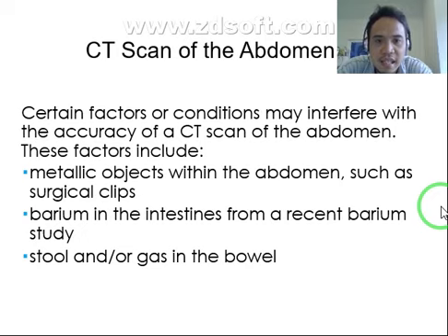Barium in the intestines from a recent barium study. Kung ang pasyente nag-undergo siya og contrast study or barium study sa conventional radiography and then mag-undergo na siya og CT scan tapos naay barium retention, naay tendency nga katong barium mag-star pattern similar sa surgical clips. And because barium suspension na ginagamit sa conventional radiography and CT scan is very different in terms of its content, dili sila compatible. So, dili mo pwede gamitin tong barium contrast sa conventional radiography sa CT scan.